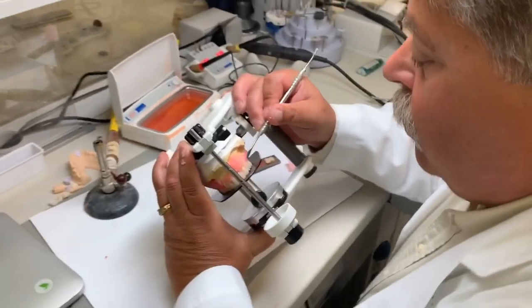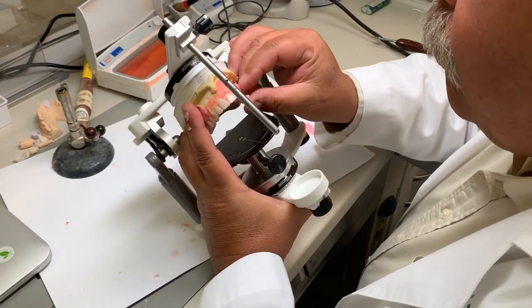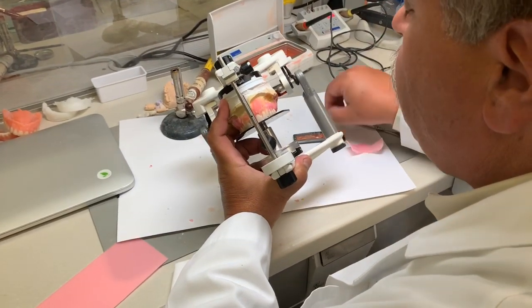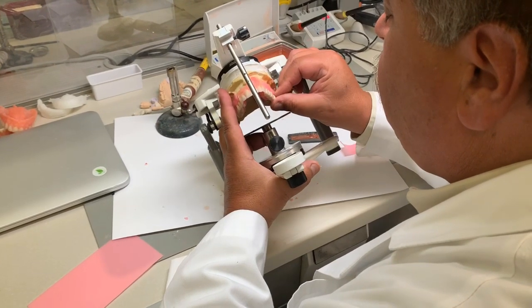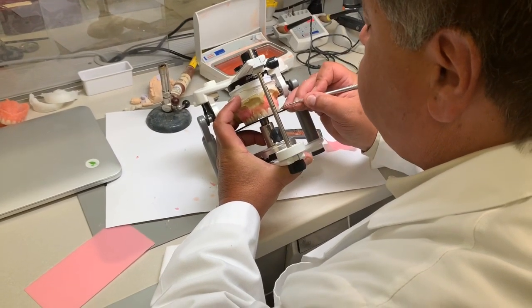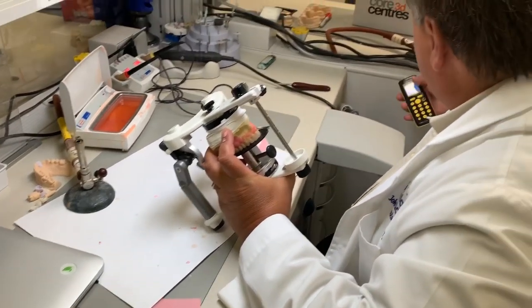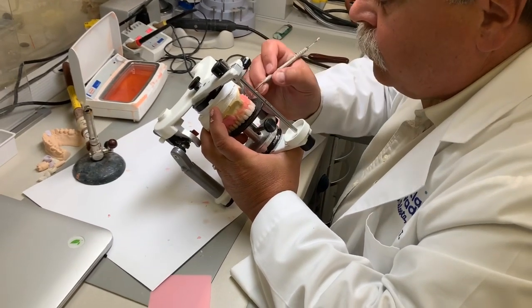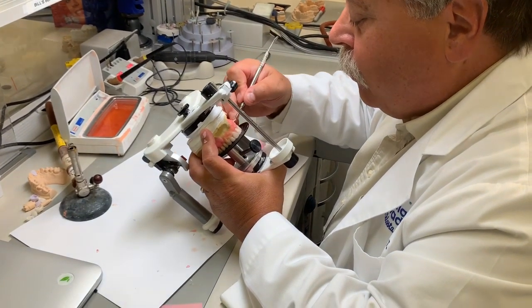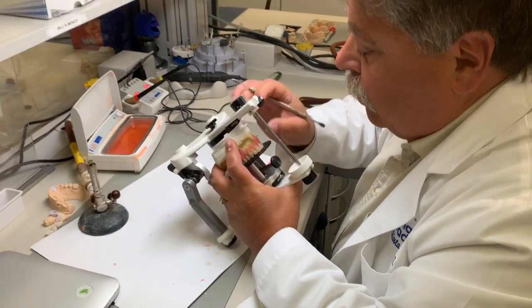Okay, now I'm doing the left side. Mm-hmm. I don't think I could ever do something like this. It must take a steady hand. It takes a little bit of practice. But now it's just like second nature to you, I assume.